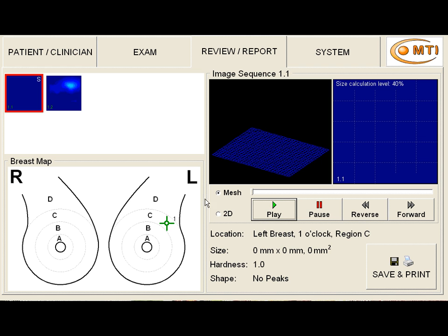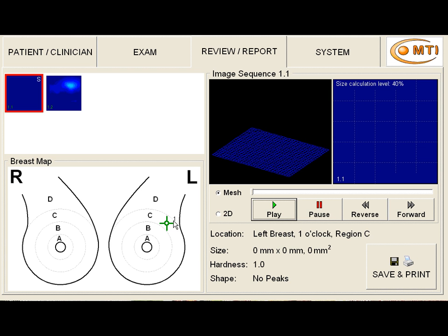And that's an examination of screening back and forth. As you go one way, all the waves, which are glandular nodularities, move in one direction. And as you go backwards, the opposite way, the waves go in another direction. But we notice that there are a couple of taller waves.